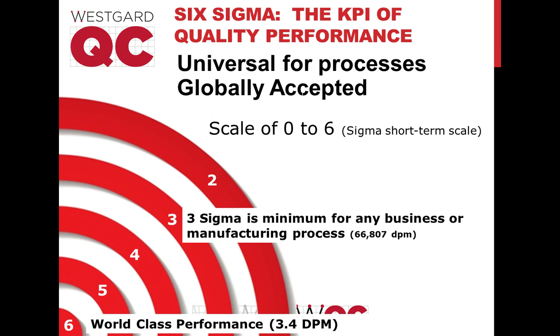And then also, I would say you're going to go with a majority sense: do I have most of my assays at 6 sigma? I have a couple assays at 4, a couple at 3. Maybe I have one parameter that's below 2 sigma. I'm probably going to design for the majority of the assays, and then for the ones in the minority, if I have 1 or 2 assays that are not very good, I'll try to take additional actions for them. That may be something I do in addition to the statistical QC, so that I might use more rules, but I might not be able to afford to run more controls or to run those controls more frequently. And on the outside of statistical QC, perhaps using the monitoring of patient values, I'm going to be doing more scrutiny of those particular parameters.